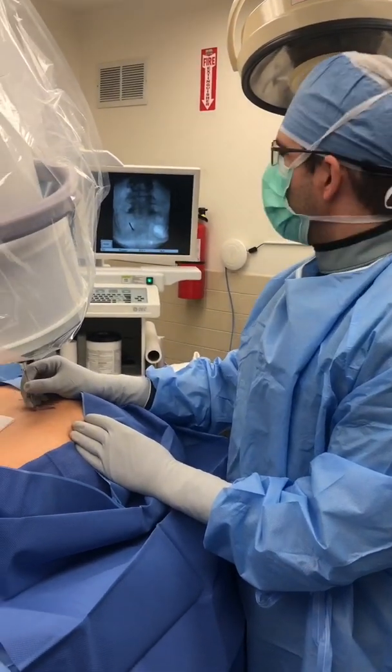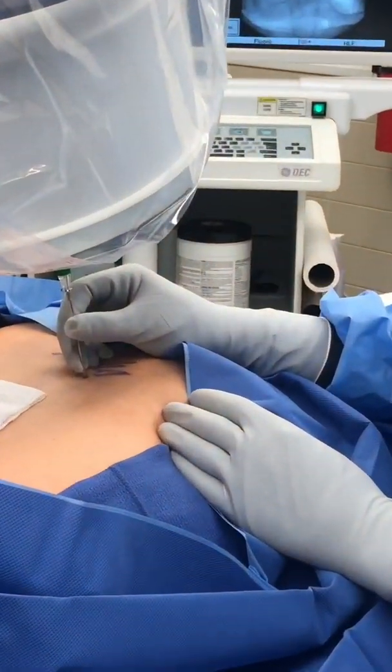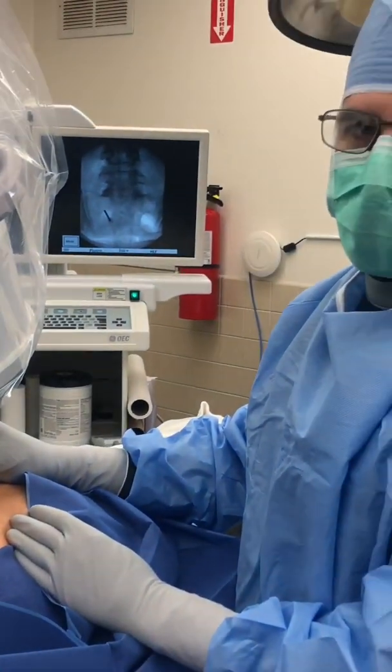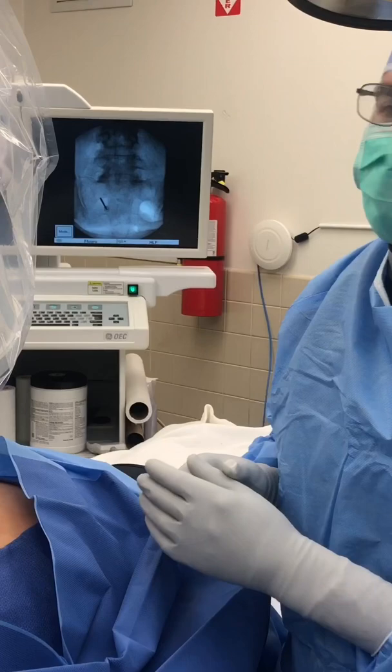We just placed the needle — this is in the S1 foramen — and we're going to confirm how anterior we are within the sacrum by performing a lateral view.